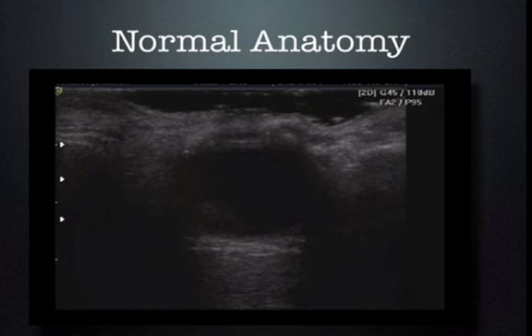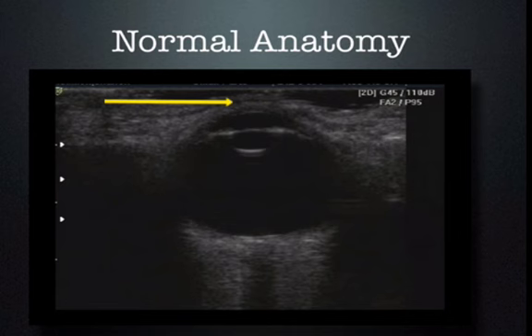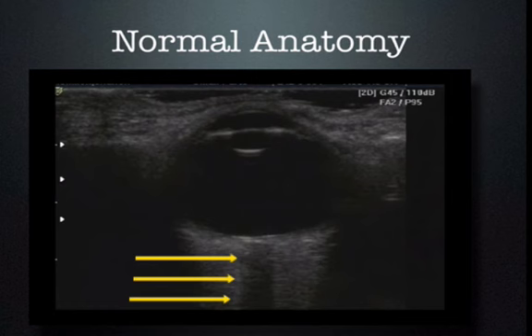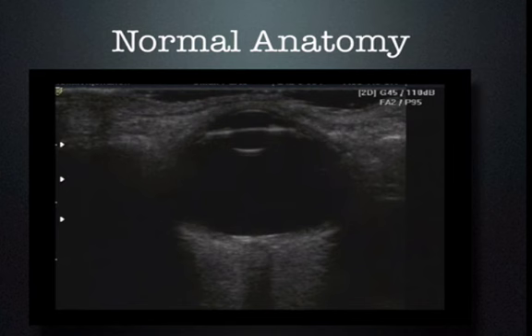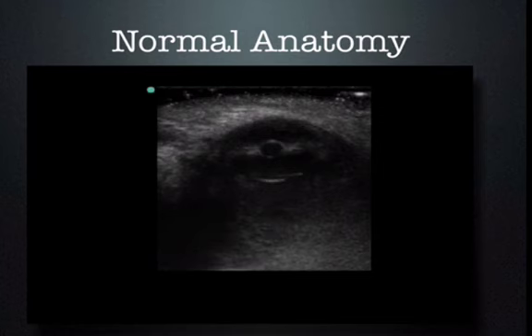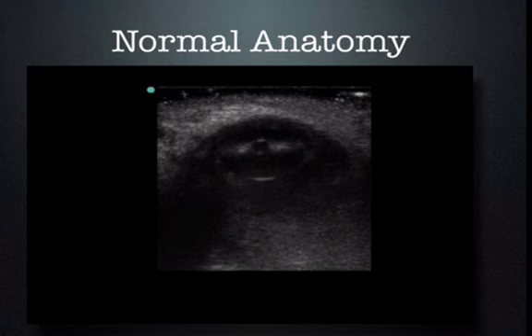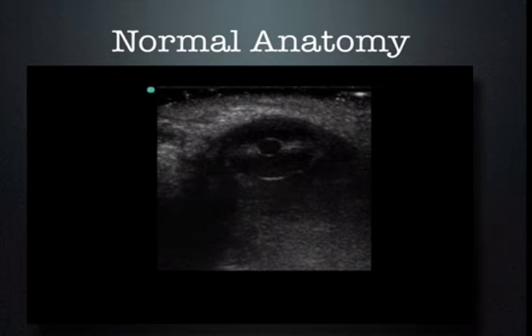Here we have a picture of a normal ultrasound of the eye. We can see the eyelid, the tarsal plate at the top, the lens in the anterior chamber, and the vitreous is nice and hypoechoic. The shadow coming out the back is the optic nerve. The retina is the posterior portion of the globe, generally a flat hyperechoic line layering against the posterior globe. When we tilt our probe, we can see the pupil, and as we shine a light into the other eye, we can see the pupil dilate and contract — very useful in a patient with a swollen eye.